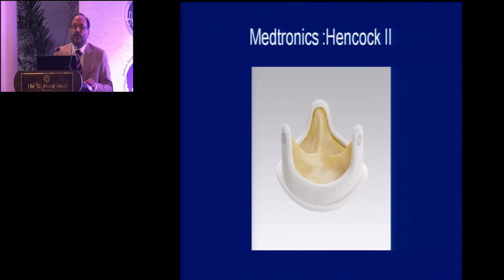This Hancock 2 was done almost 10 years down the line, when suddenly many people started using this kind of bioprosthetic valve, because they gave a very good idea that the longevity of these Hancock 2 is very high. They claimed up to 25 years of longevity for these kinds of valves.